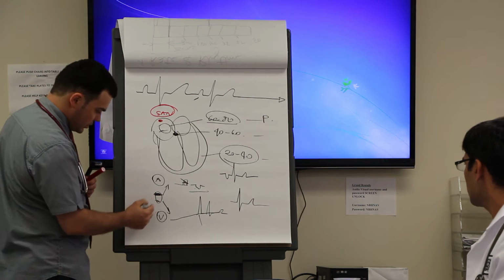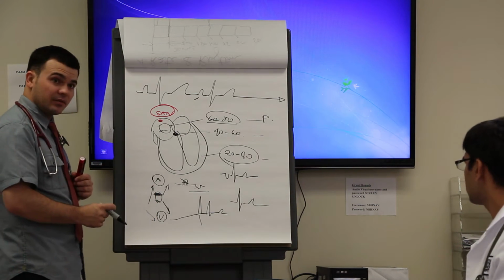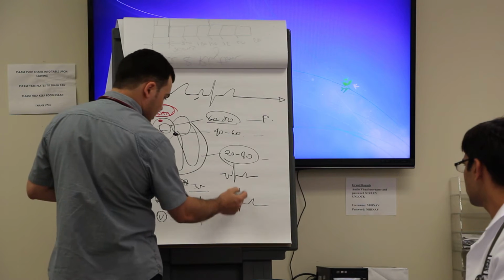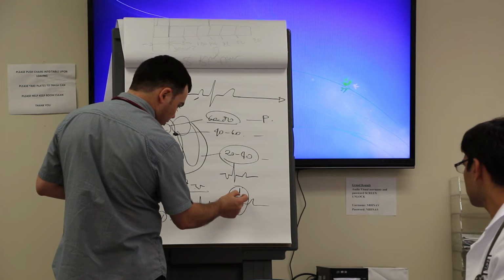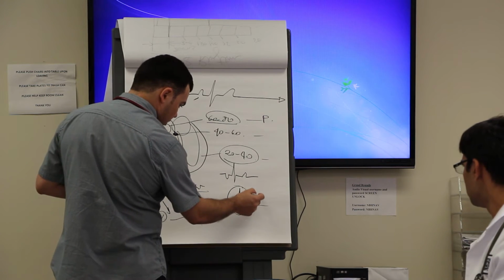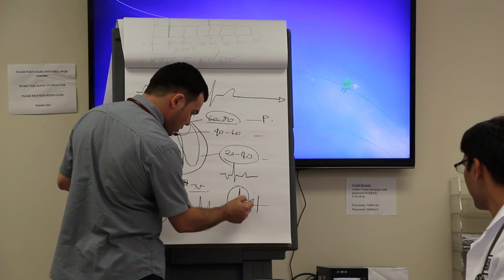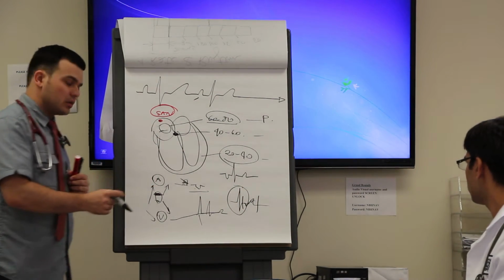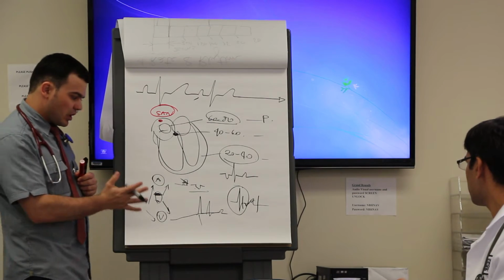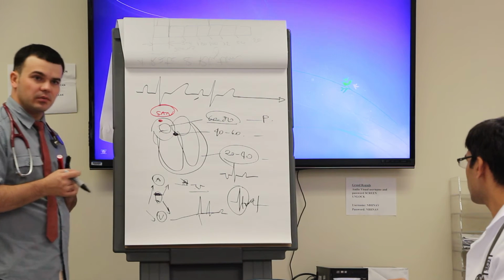And the last one, when it's far low, the first one to be hit is the ventricle, right? So the ventricle is going to see this first, right? And then the P wave can be anywhere from here to here, right? So sometimes you see a little shoulder, or sometimes you see a retrograde P here, or making a little shoulder on the T, all right? So a lot of times you may not see it, right? So consider junctional escape rhythm.